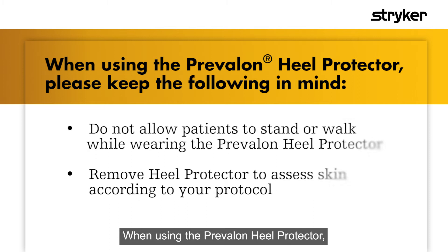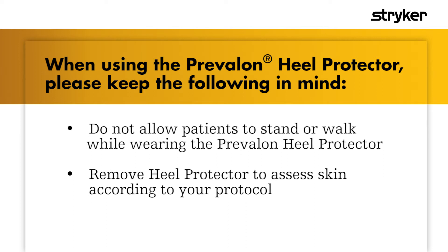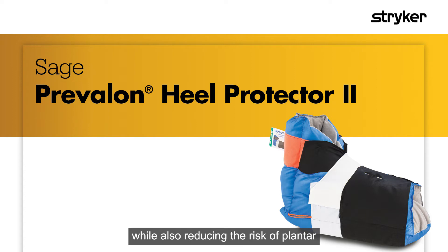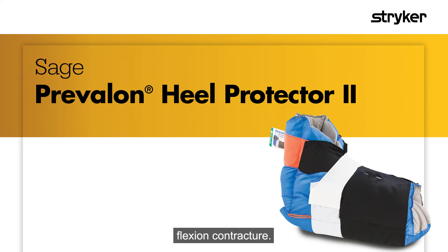When using the Prevalon Heel Protector, please keep the following in mind. The Prevalon Heel Protector offloads the heel to provide continuous pressure relief while also reducing the risk of plantar flexion contracture.